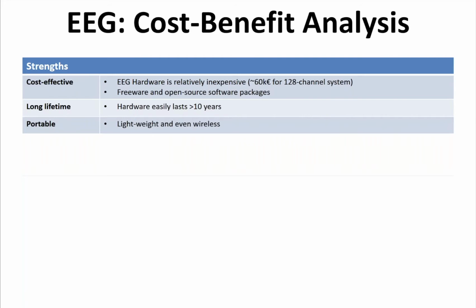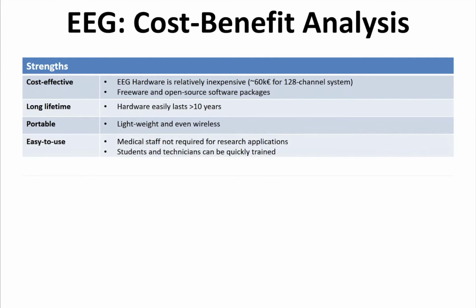It's portable. Systems now are very lightweight and even wireless. They're easy to use. It's easy to train up medical staff, students, technicians. You don't actually need technical expertise from a medical standpoint for most research applications.